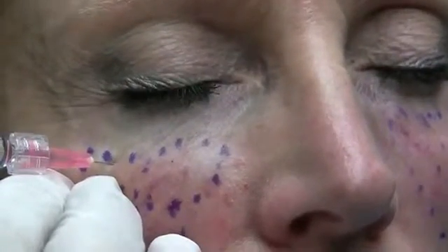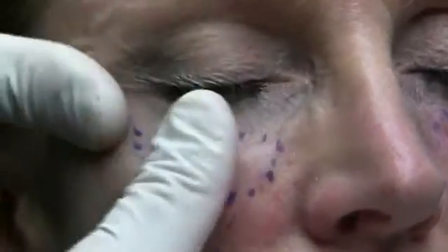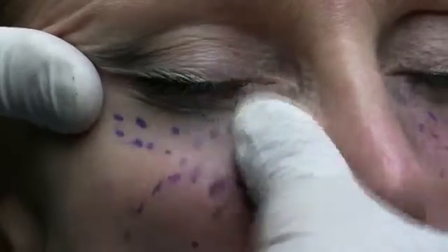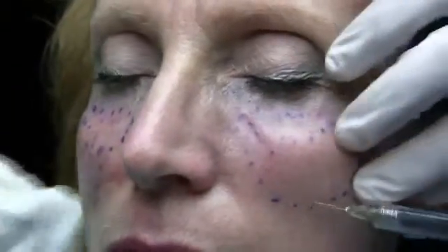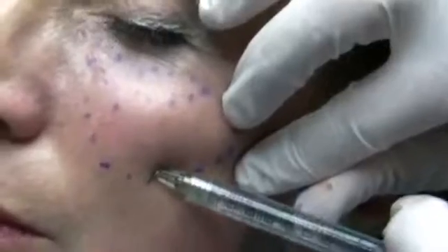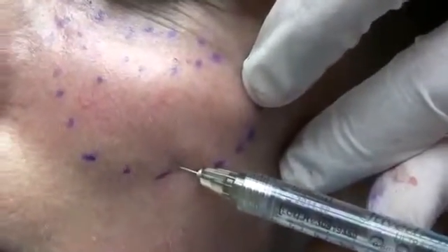I tell these patients to expect bruising. And then what we're going to do is we're going to massage these areas out. And this is two syringes here. We've got a syringe on each side for the tear trough and cheeks. And now we're going to take a syringe. This happens to be Ultra Plus, so we're being very ecumenical today. We're using everybody's products. And we're just going to go back and add.